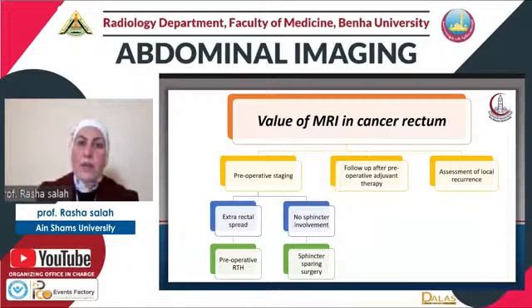And to sum up, the MRI in rectal cancer is very helpful in preoperative staging, especially to assess extrarectal spread for the extramesorectal lymph nodes or distant metastasis, and also for assessment of sphincteric involvement, if present, if there is a plan for sphincter sparing surgery. It is very helpful in assessment of treatment response after concurrent chemoradiotherapy, and also it is very helpful in assessment of local recurrence. Thank you.